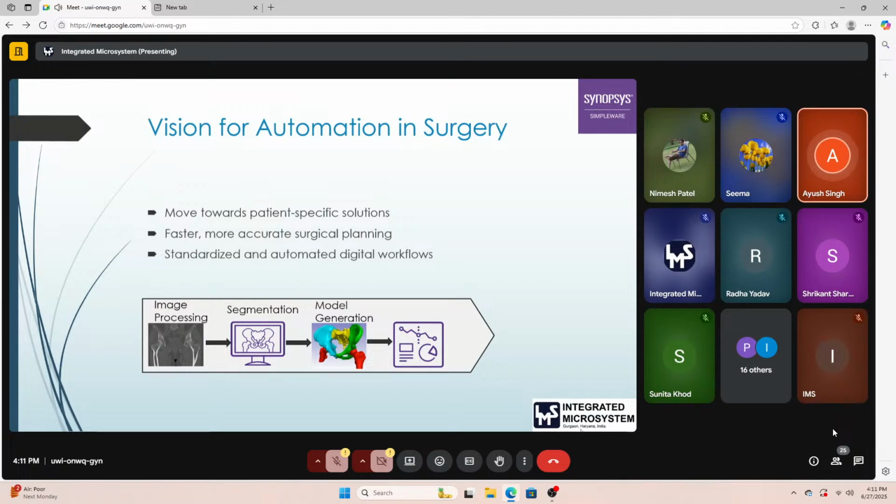Basically, there are four types of model generation capabilities. The first is finite element model generation, the second is computational fluid dynamics model generation, the third is NURBS model generation, and the fourth is surface model generation. Why did we highlight all these model generations? Depending on the task, we might require an FE model if we need to do analysis and check wear and tear of an implant over a period of time with the particular image anatomy that you are working on. For cardiovascular or hemodynamics cases, we might require a CFD model to check the blood flow, and likewise for the respiratory system.